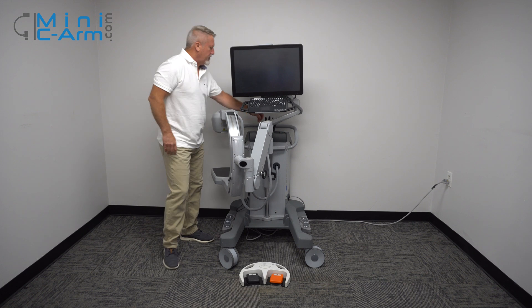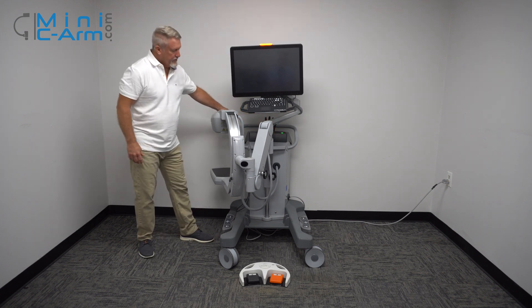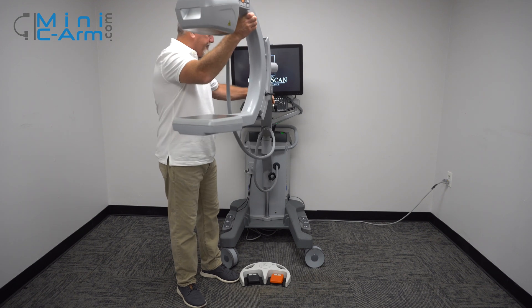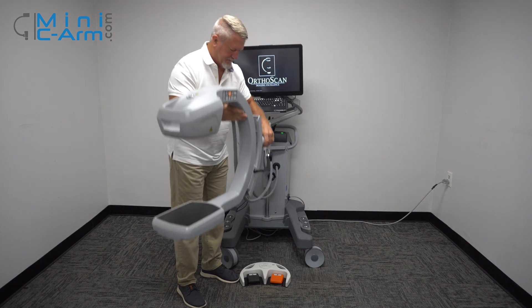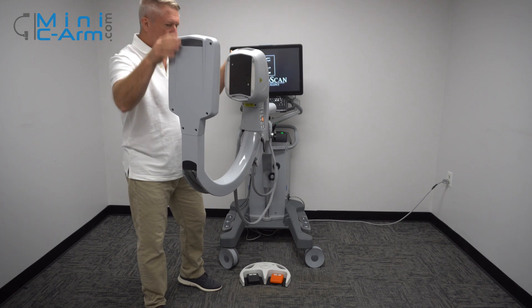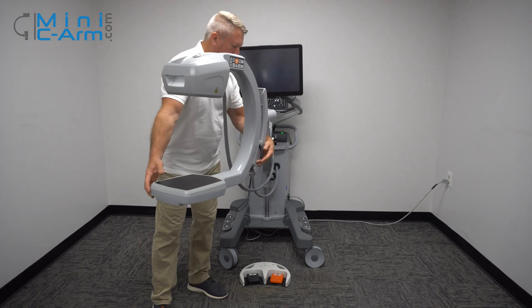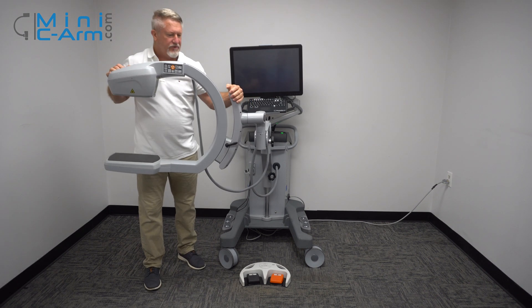To turn it on, just press the green power button over here. While it boots up, we'll show you a little bit of the articulation of the C-Arm. This has an over-rotation mechanism — that's this part here. Here's your wig-wag.